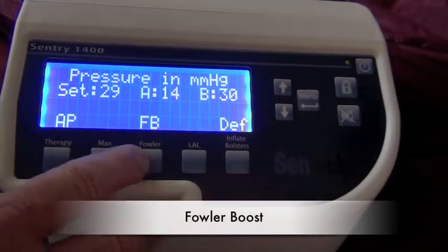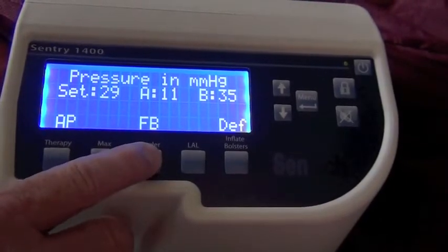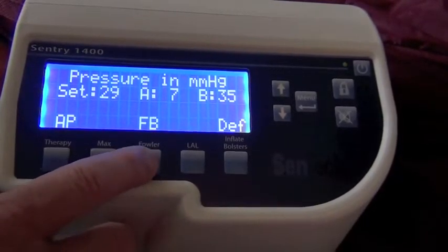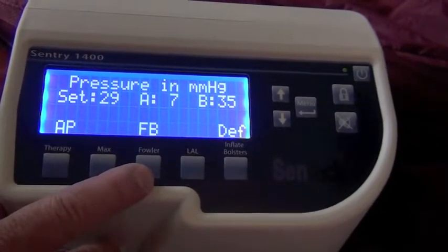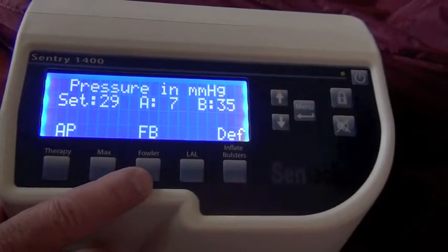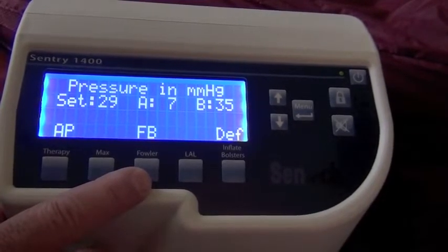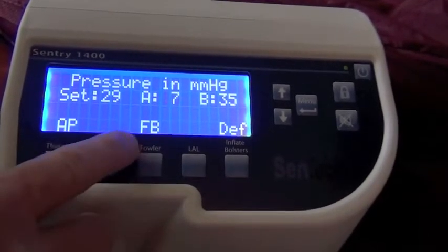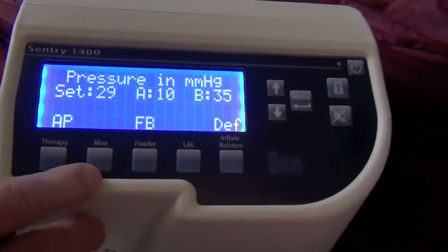Fowler, the indicator here is FB, which stands for Fowler Boost. And what we're doing basically is we're adding about an additional 20% of airflow to the mattress to compensate for a patient who was supine and who is now in a Fowler or semi-Fowler position. And gravity is going to dictate that when you're laying flat, there's so much pressure under your bottom. When you're sitting up, that vertical load shifts, and there's considerably more pressure now simply because of load being applied to your bottom. So we need additional air in the system to offset your tendency to go deeper into the mattress. And that's what Fowler Boost is for.